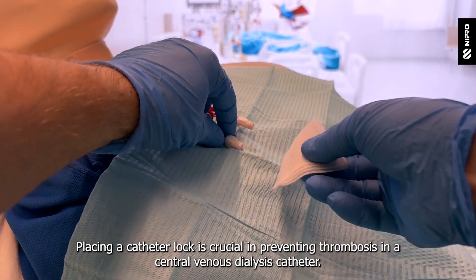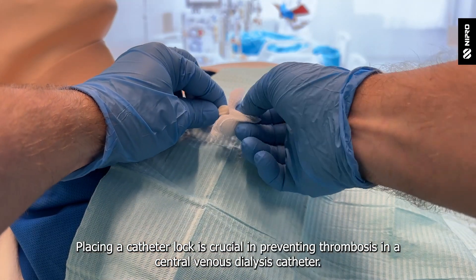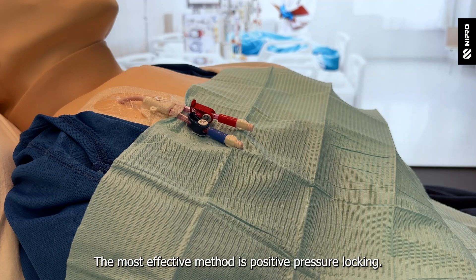Placing a catheter lock is crucial in preventing thrombosis in a central venous dialysis catheter. The most effective method is positive pressure locking.